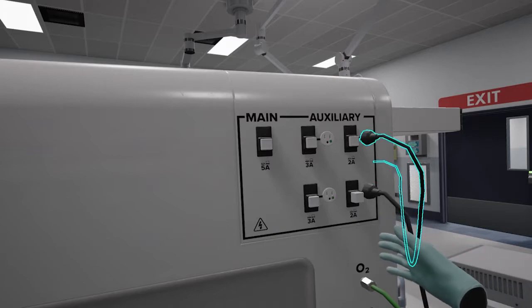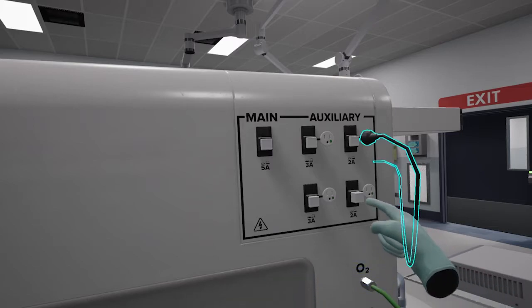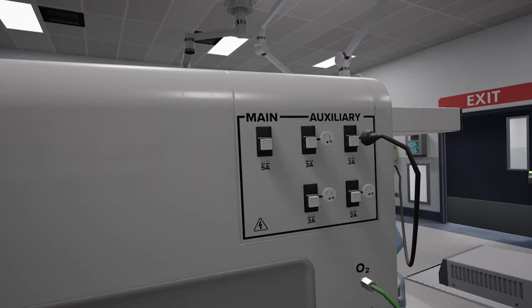So what we need to do in this case is unplug the electrocautery unit, we'll ask the circulator to plug it into another outlet somewhere, and we can re-engage our circuit breaker.